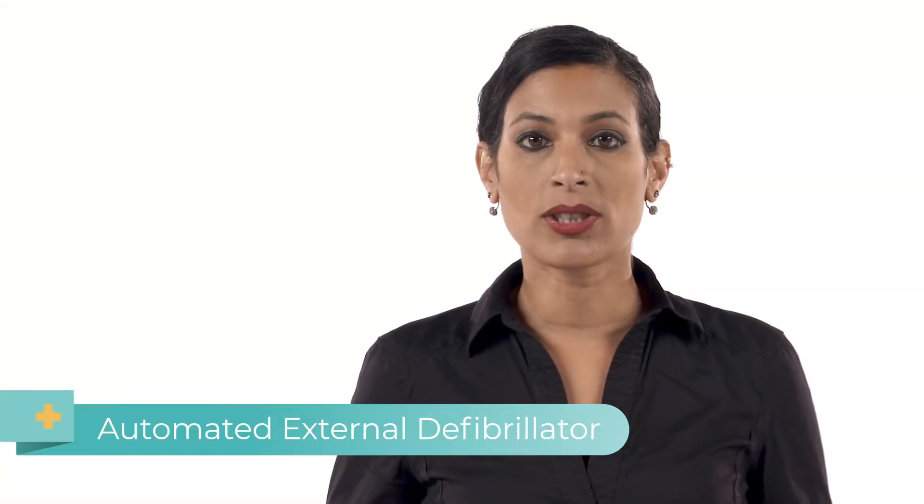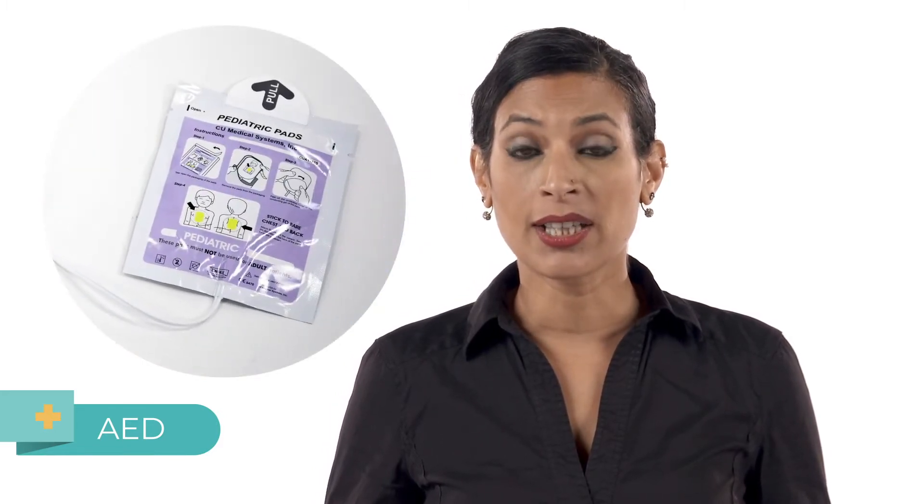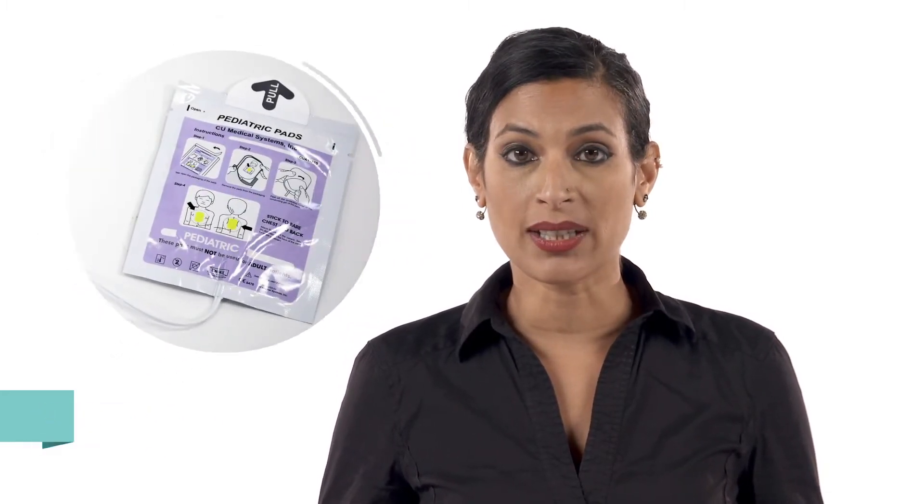An automated external defibrillator, or AED, is a life-saving machine. An AED can be used on children over one year old if their heart has stopped beating. It gives the heart an electric shock to start it beating again.